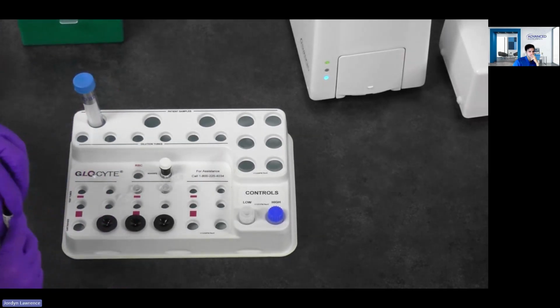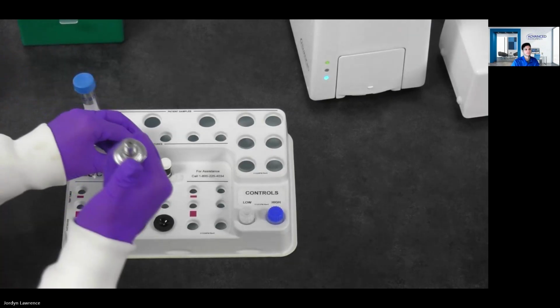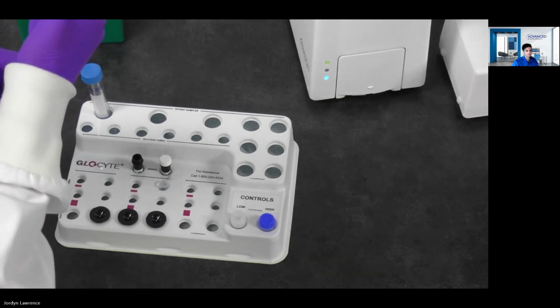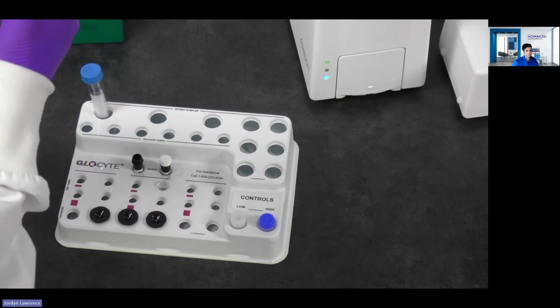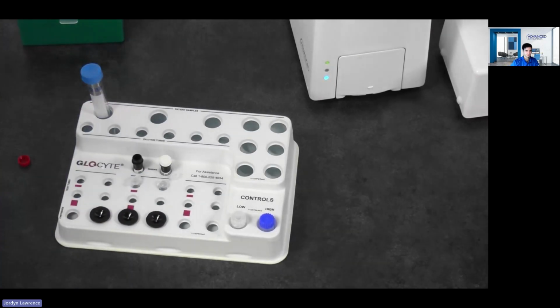And I'm going to pipette 30 microliters of our red blood cell reagent in and mix this 3 times. And I'm going to let this one sit. This one needs to incubate for approximately 3 minutes. Don't really want to go over 15 minutes, but your lab gets busy, so you'll see how quick this runs.